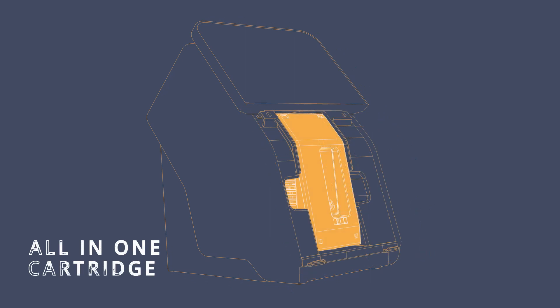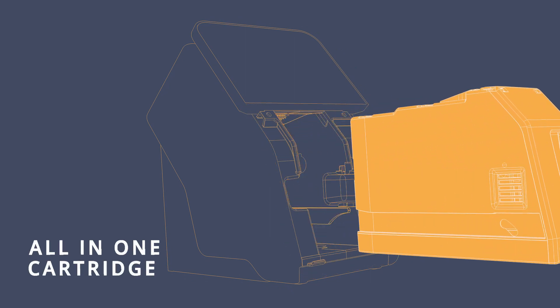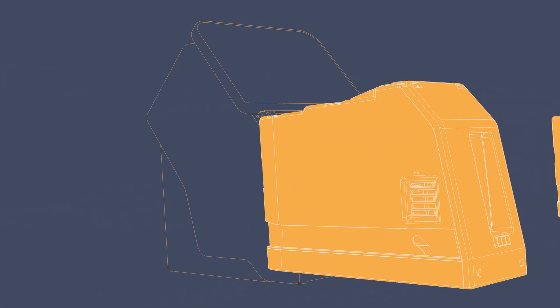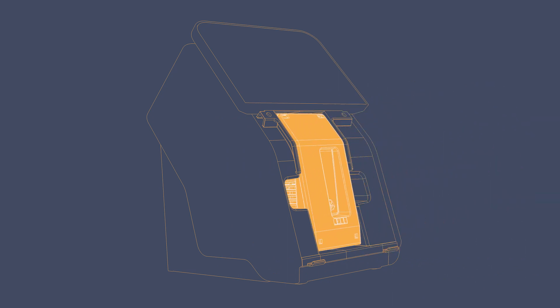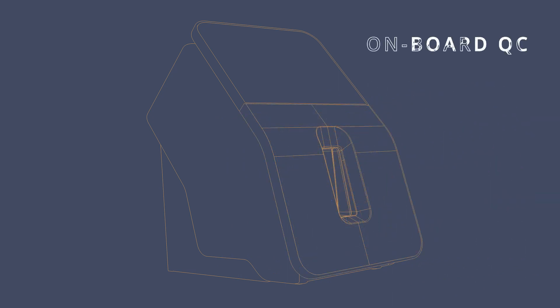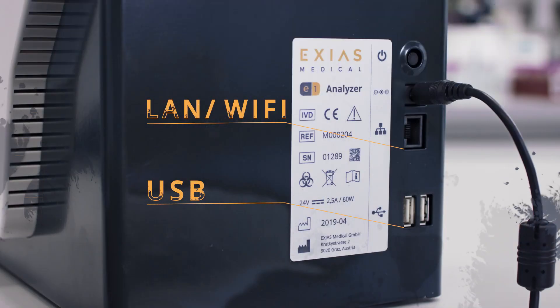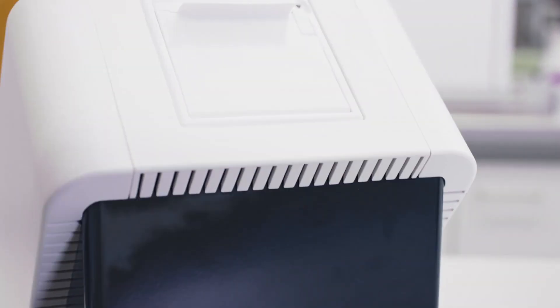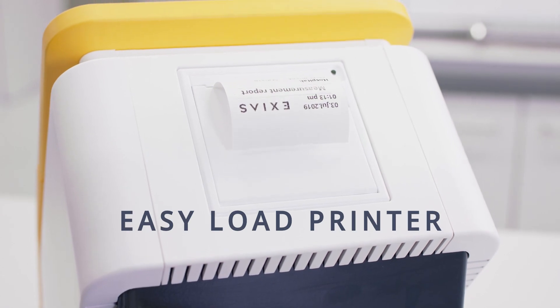The all-in-one cartridge, which can easily be replaced in a moment, includes all maintenance parts like sensors, reagents, waste, and even quality controls. The system is equipped with full data connectivity and a built-in easy-load printer.